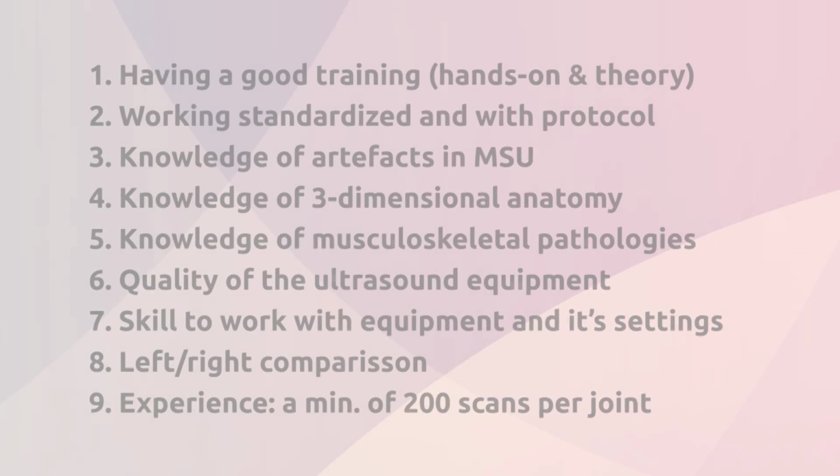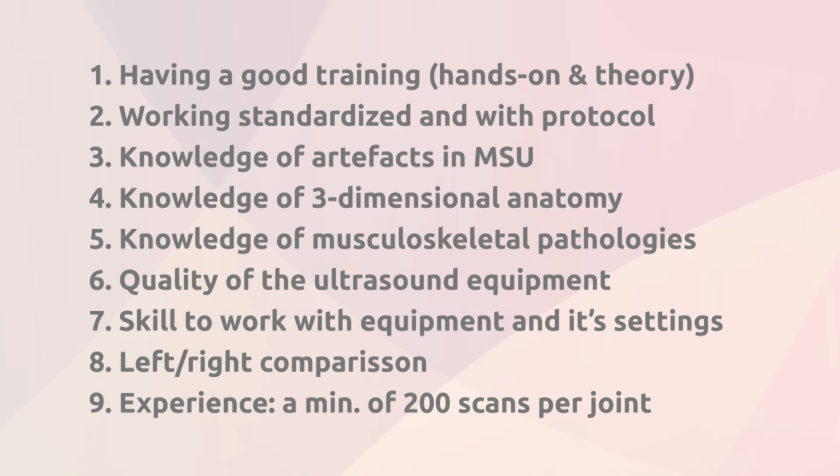MSU comes with a high general diagnostic value, equally to MRI. The high diagnostic value of ultrasound is strictly related to a few important criteria. MSU's diagnostic accuracy is not profession dependent, but user dependent. Anybody can do it as long as they fit the criteria described on this slide, but only as long as they use MSU a lot, since there is a long learning curve. This long learning curve goes for every profession.